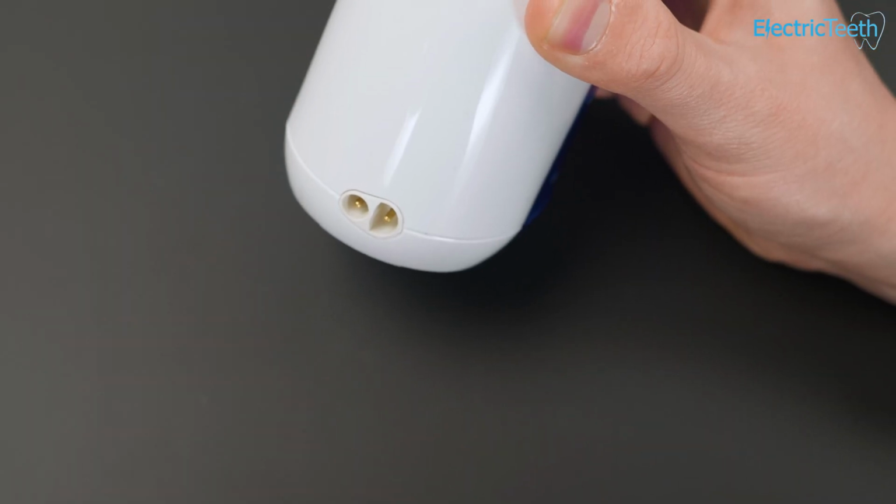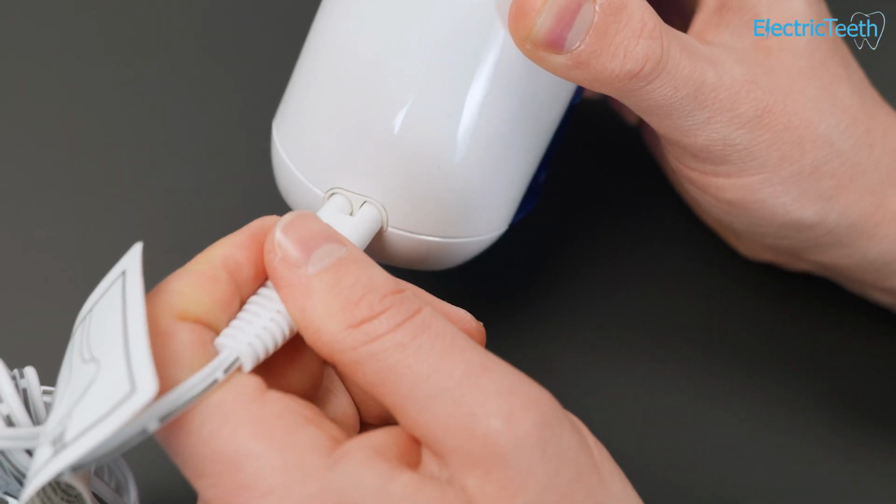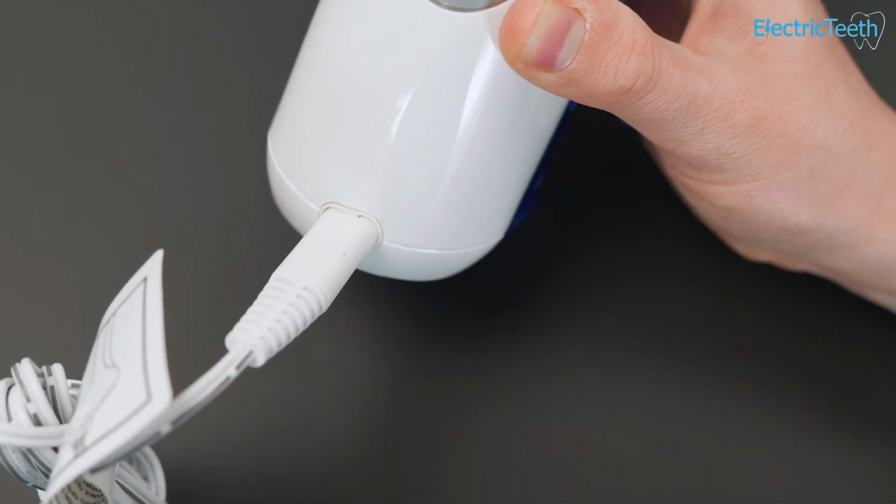And the same goes for when you're actually charging it. You connect up the power cable, but you can't say for sure that it's actually charging because there's no flashing status indicator light. You don't know when it's fully charged. You basically just have to leave this on charge overnight and assume that it's fully charged.